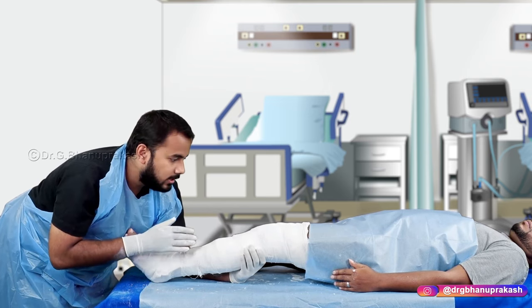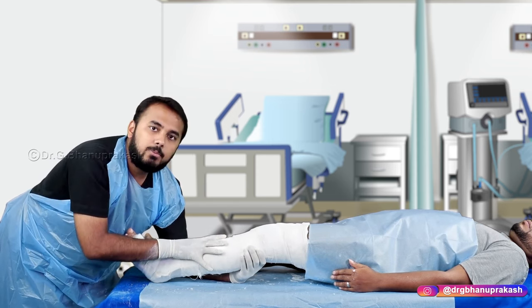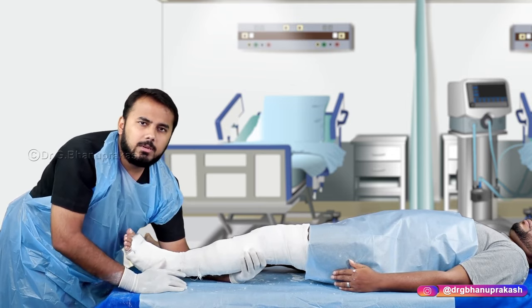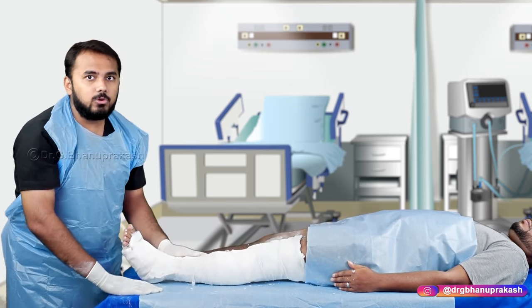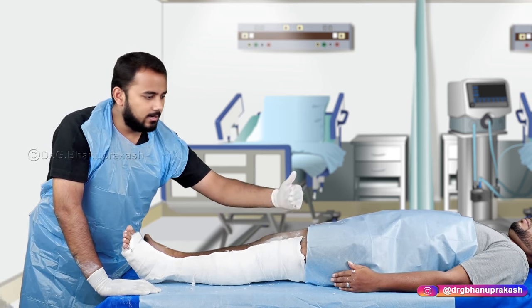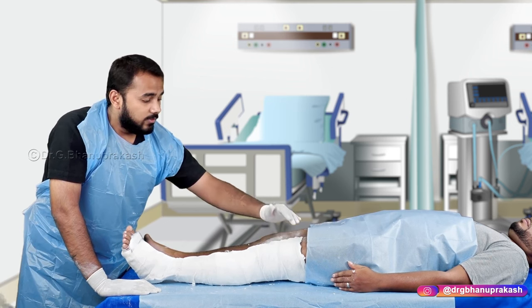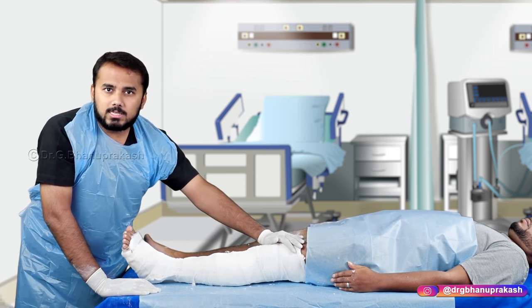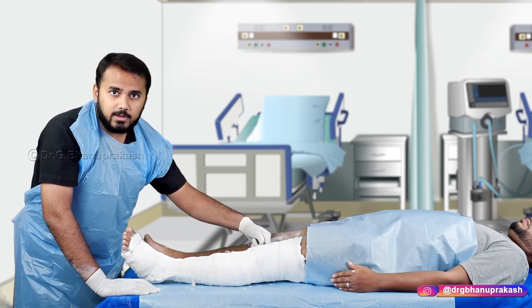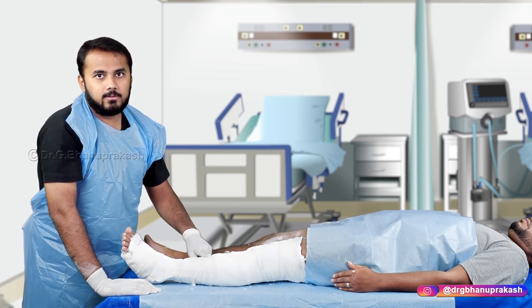This type of slab is called an above-knee slab — meaning the slab extends above the knee, up to the mid-shaft of the femur. You apply an above-knee slab for fractures of the distal femur and mid-shaft fractures of the leg where both tibia and fibula are broken.